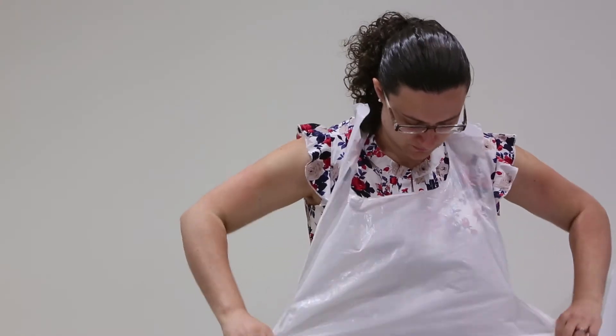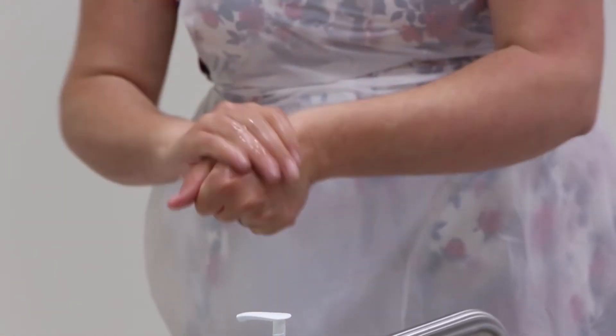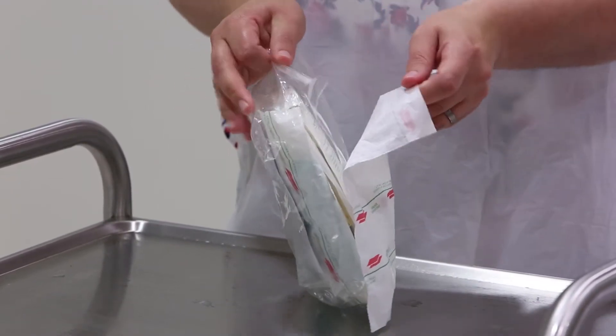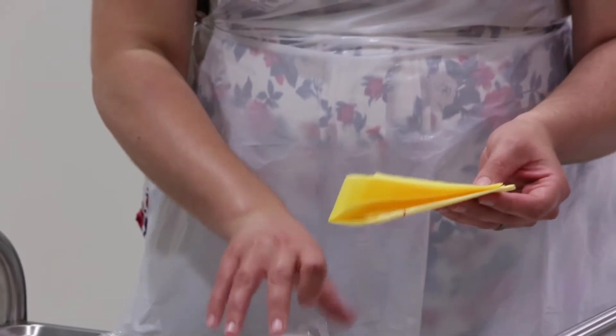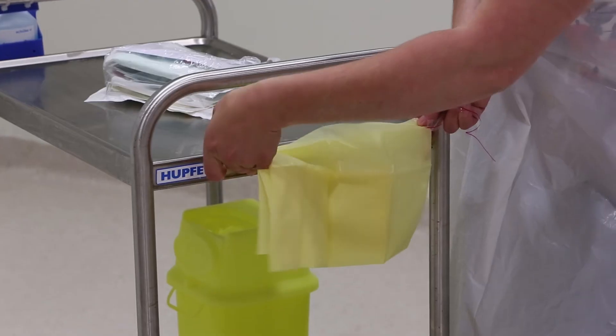Wear the apron. Once again clean your hands with alcohol hand rub. Place your equipment and the items of the blood culture pack on the surface you have just cleaned. Attach the yellow plastic bag provided to the side of the work surface being used.